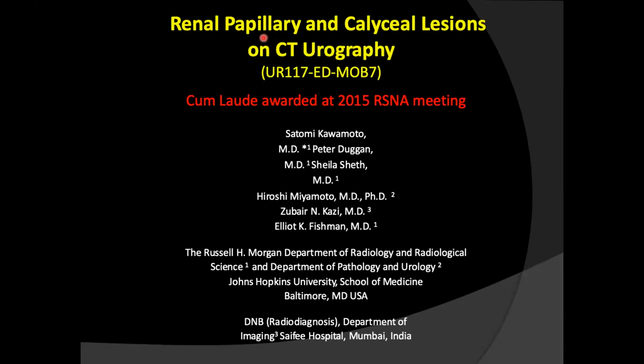Presence of the pelvis beyond the renal hilar margin should raise the suspicion of an extrarenal pelvis. So you will get extrarenal pelvis also with hydronephrosis. If you see the renal pelvis beyond the hilar margin, that is extrarenal pelvis. In addition, if you see dilatation of the calyces also, that is extrarenal pelvis with hydronephrosis.